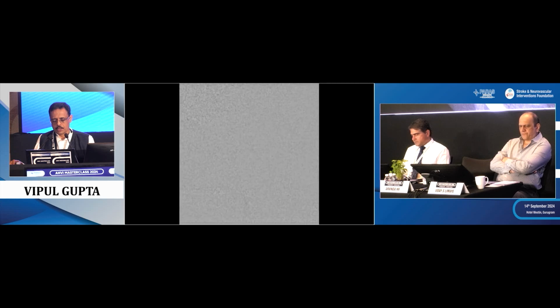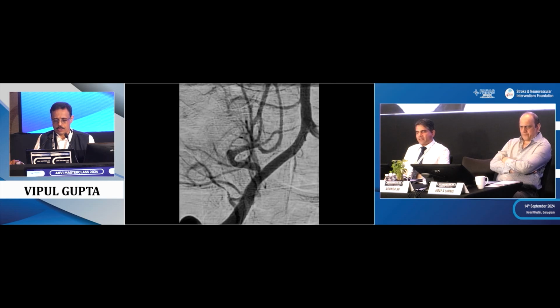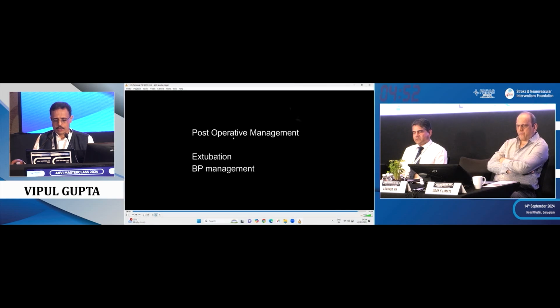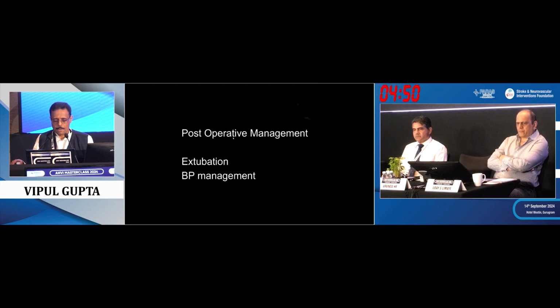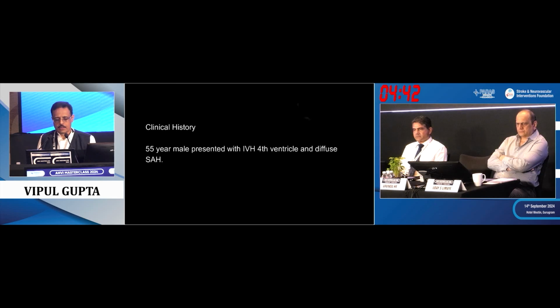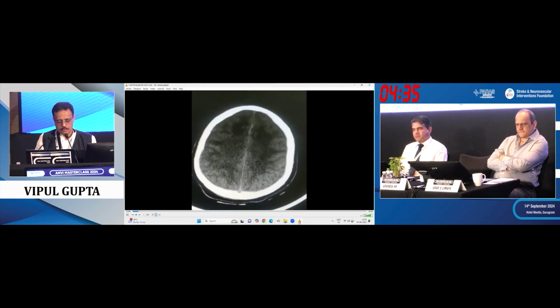And I think we have a check angiogram of this patient as well. I think during the stay we did a check angiogram, like sometimes we do in ruptured aneurysm. What's really happening is an early check angiogram, and then I think we have a delayed check angiogram. So whenever we extubate such a patient, we tell them to keep. This is the delayed angiogram. So there is stenosis in the artery, but it remained patent and the patient remained fine, and ultimately he has done well.